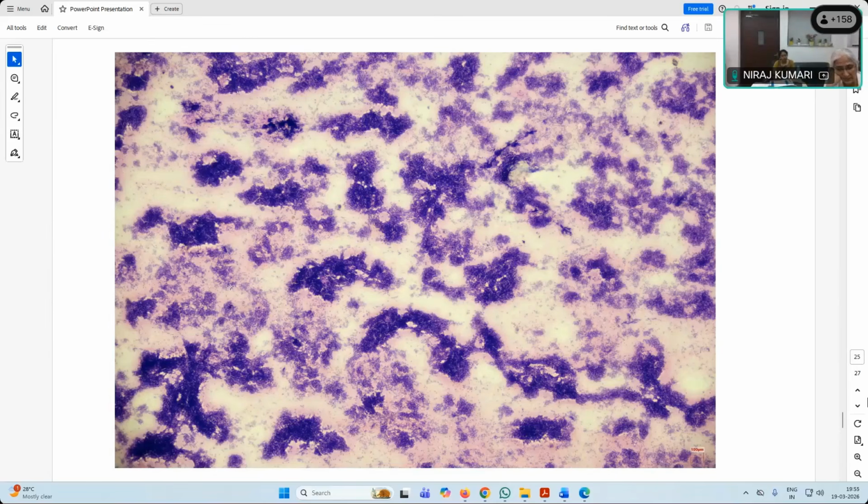Sagar once again. Dr. Sagar, are you there? Yes, ma'am, I'm here. Okay, so can you just describe this image? Ma'am, my basics are weak. I cannot confidently describe the slides. I told you, at low power, what do we have to see? At low power, I can see the cellularity. Highly cellular. Okay, yes. And do we see any pattern? Any arrangement?